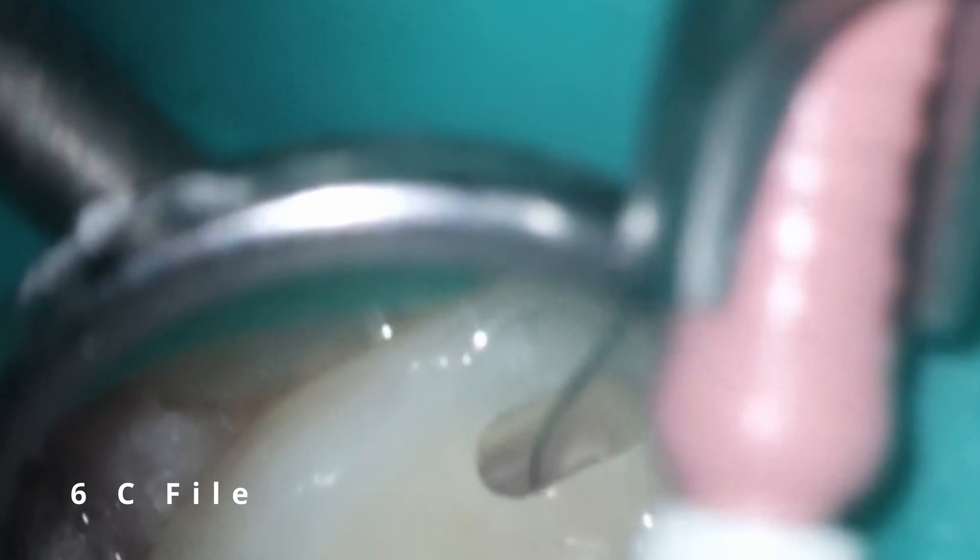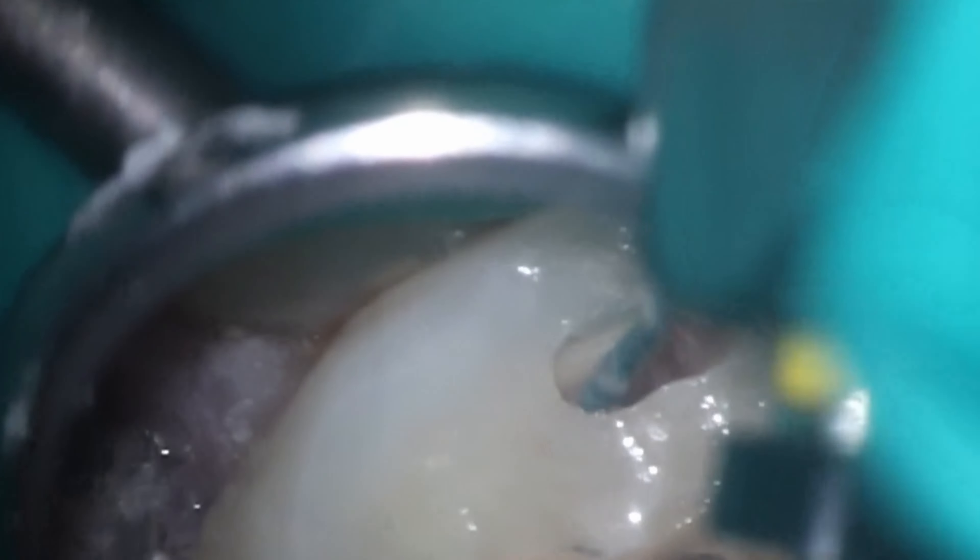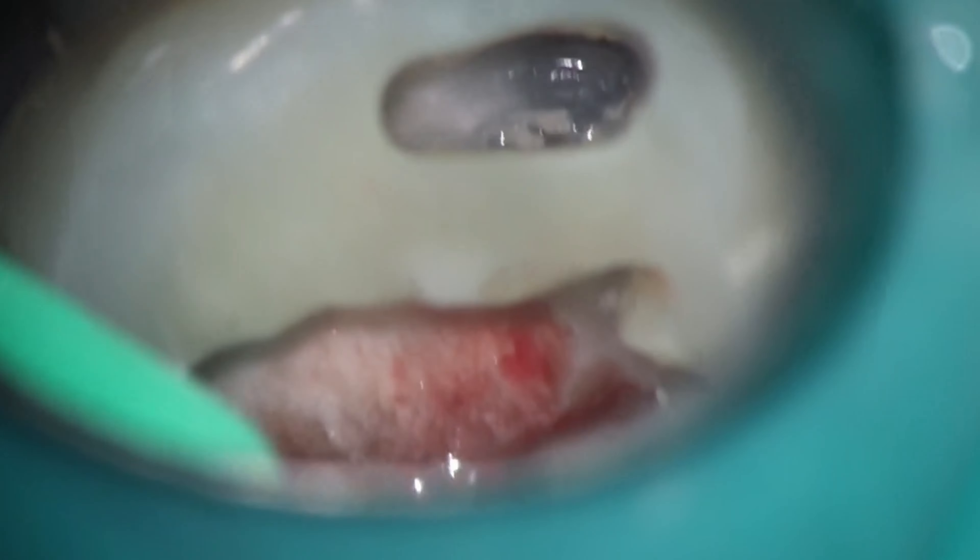When you're dealing with curved canals, one of the first things you want to do is use something skinny. I started off with a 6C file, and I still use the 20-06 on the MB1 just to kind of open it up. The case is very long — working length here is about 24mm for all the canals. Starting now to hunt for MB2. My MB1 was really straightforward here. Looking at the cone beam — and you know me, I always search for MB2. Just a little bit of troughing to start to pick it up. I still am not able to grab that MB2, and you can see that dust accumulating in one little spot — that's where we are going to be going.